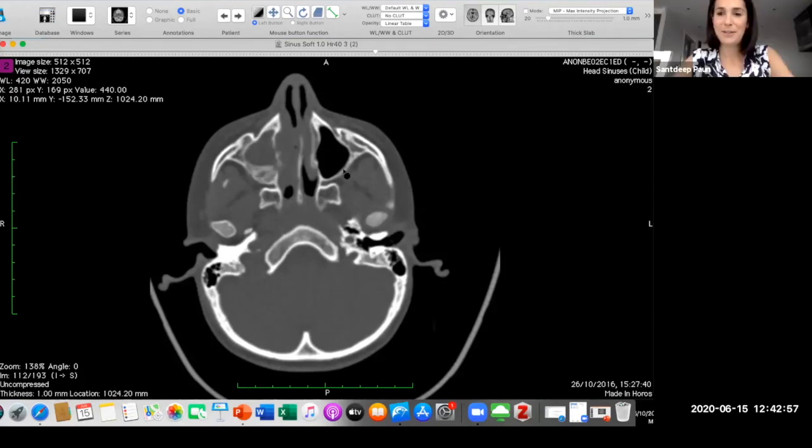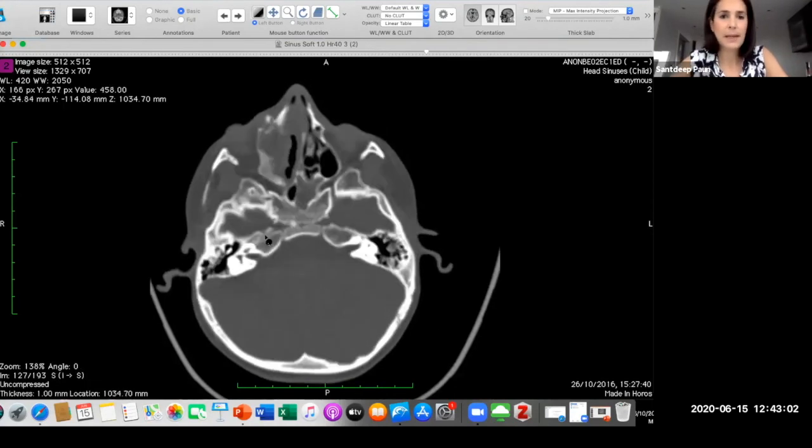Thank you very much. Right. There were some really clear slides, really helpful in describing common and rarer pathologies, and a really systematic approach to interpreting scans.